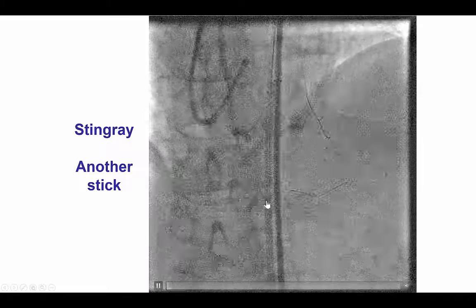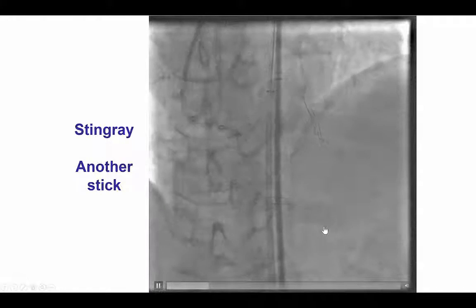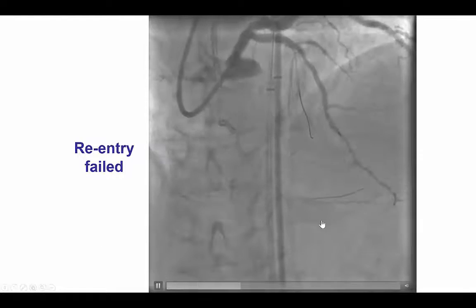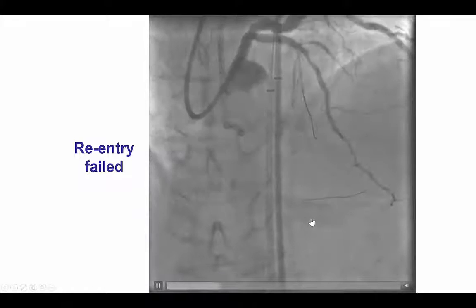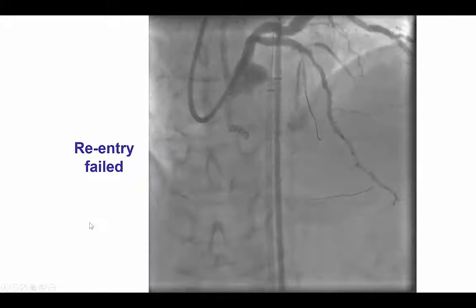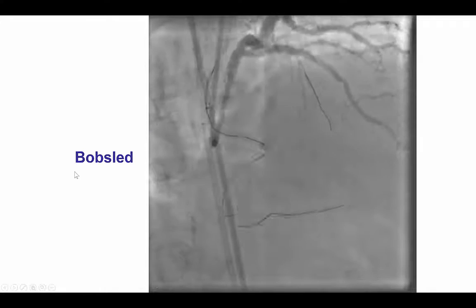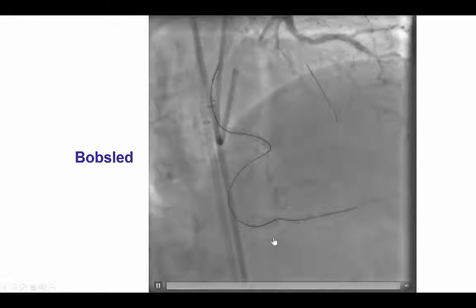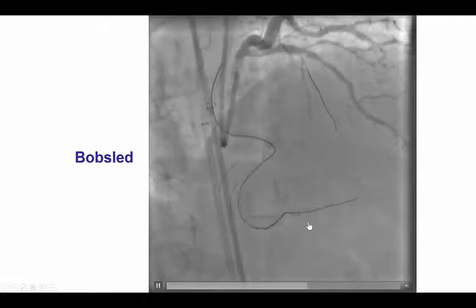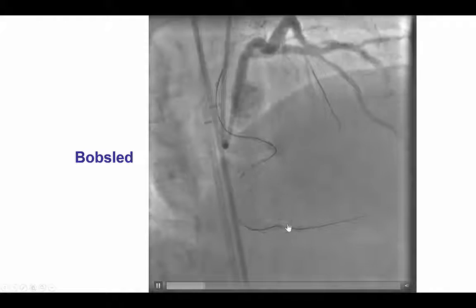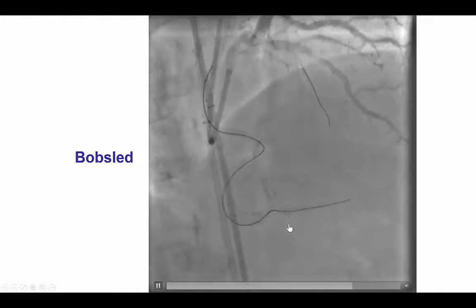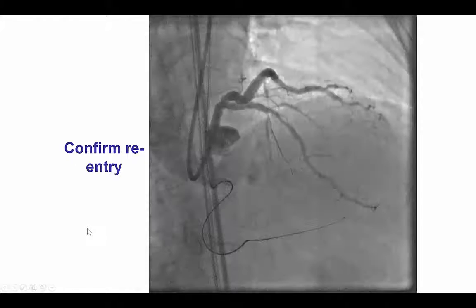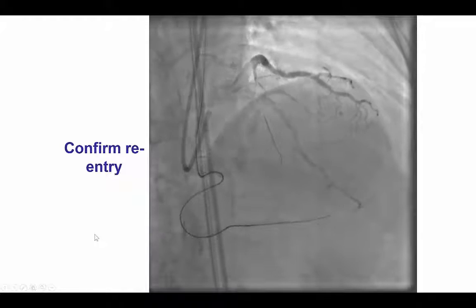Eventually, we were able to advance the PILOT 200 guidewire into what appeared to be a vessel; however, on second view, this was not really the vessel. So we attempted to reenter again. We did what's called a bobsled, which is advancing the Stingray balloon to a slightly different location into the target coronary vessel. By doing that and using a Stingray guidewire, we were then able to enter into the distal vessel, as confirmed by two orthogonal projections.